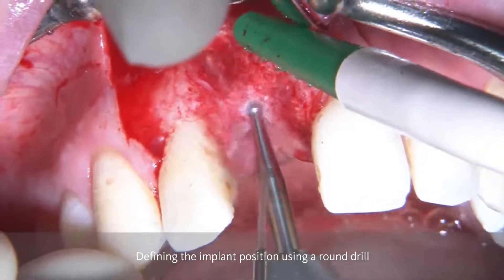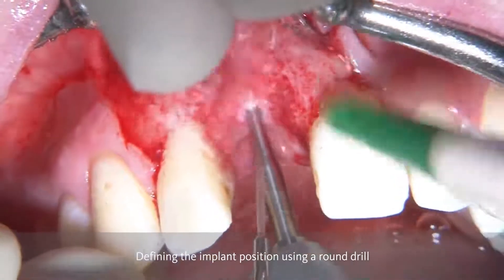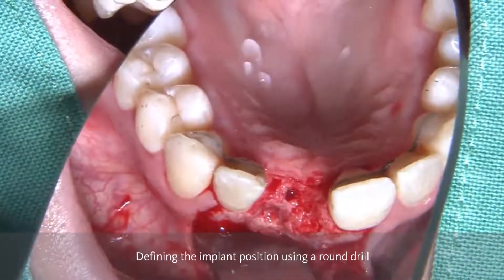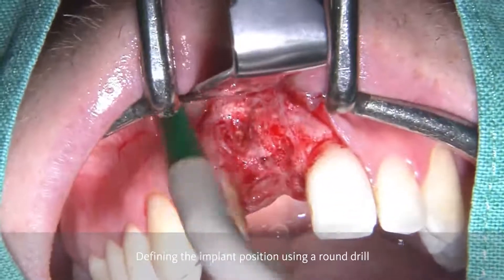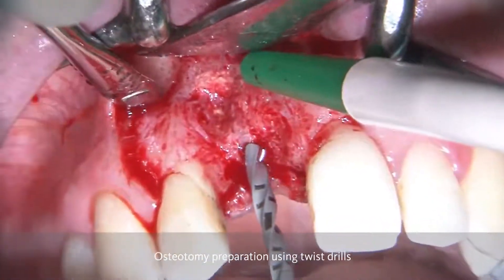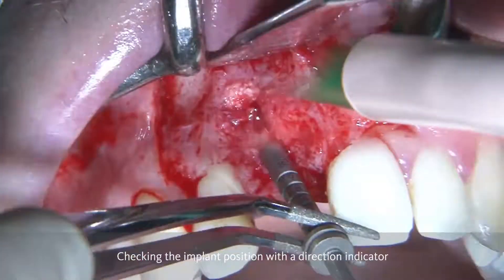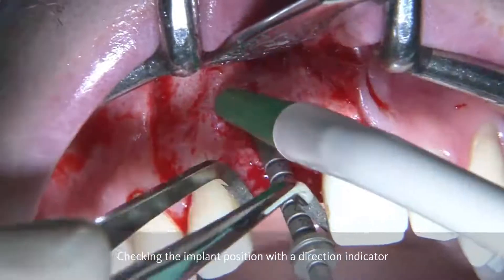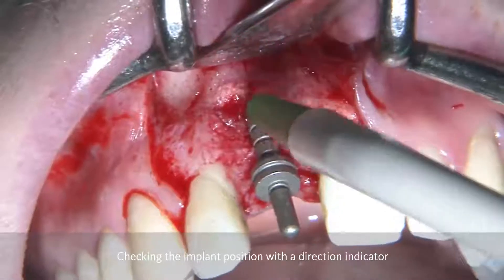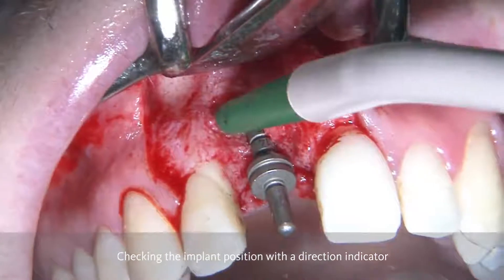As a first step, the implant position is going to be defined by using a round drill and checking its position. Then it follows by using the twist drills in order to prepare the osteotomy for the implant. After this drilling process, we always check the implant position by having a direction indicator to see whether we are correct from a mesiodistal point of view, from a vertical point of view, and a buccal point of view.